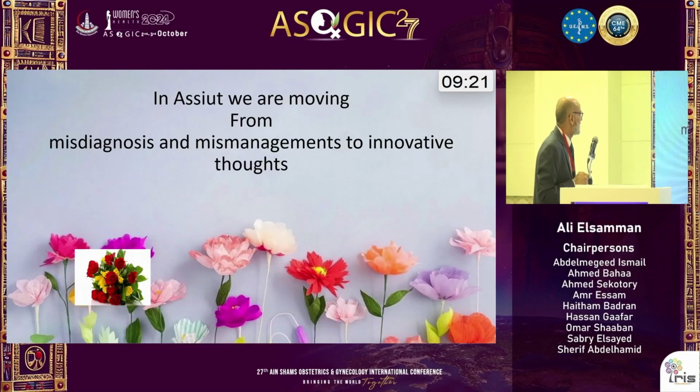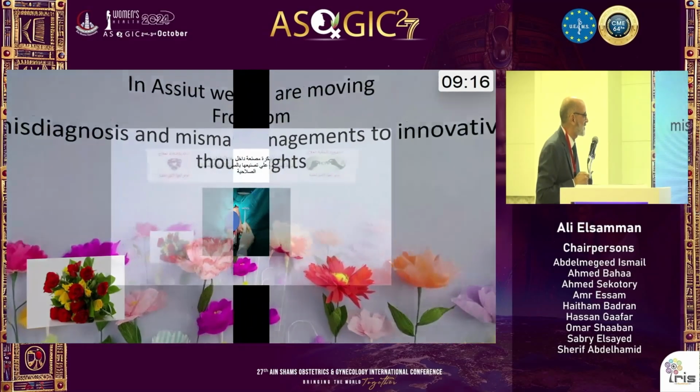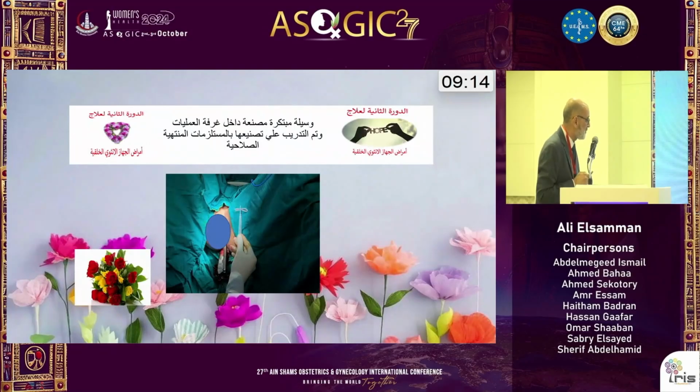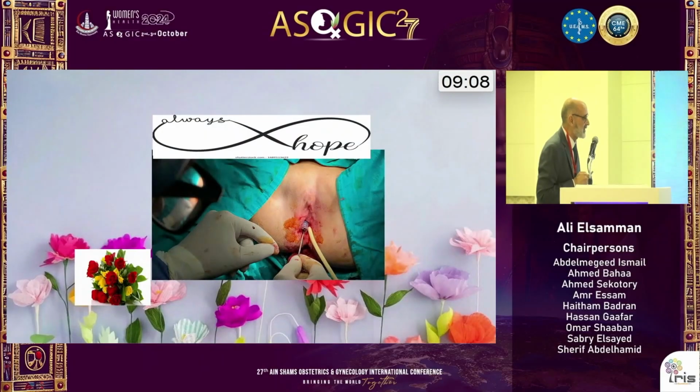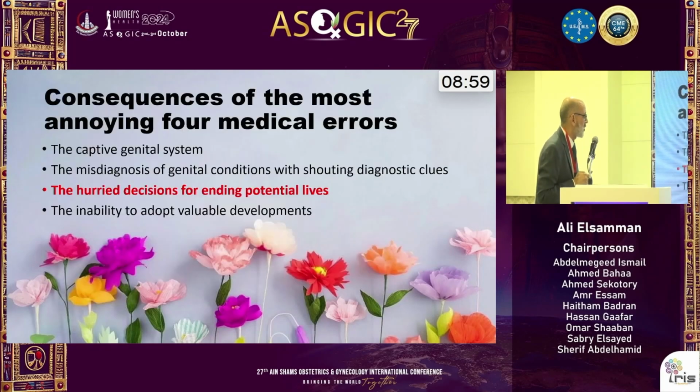In Asyut University, we are moving from misdiagnosis and mismanagement to innovative thoughts, like this simple tool made from a pediatric silicone catheter in order to treat distal vaginal atresia, a T-shaped self-retaining stent for solving this problem.